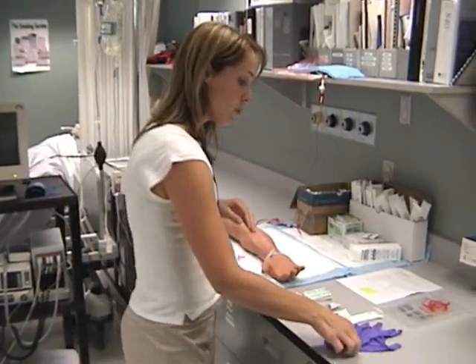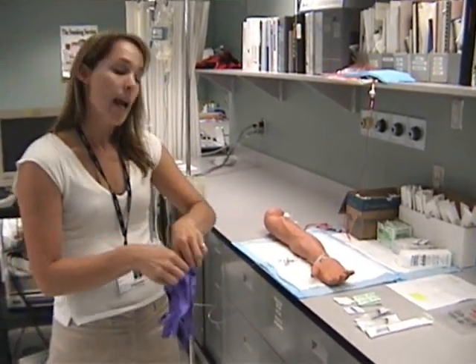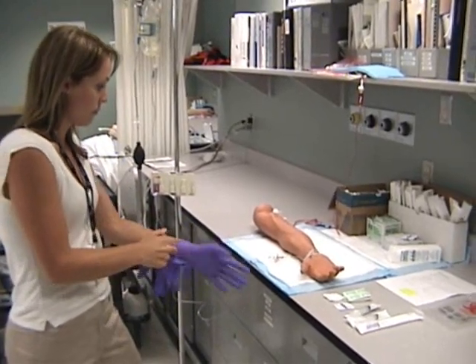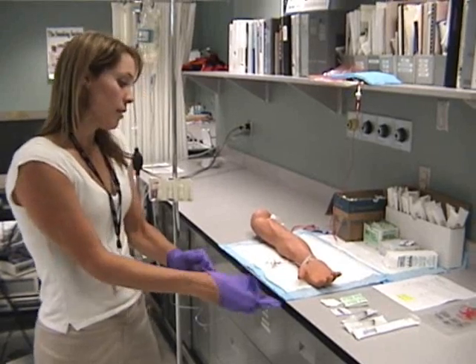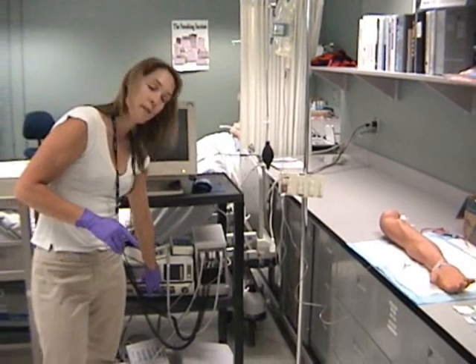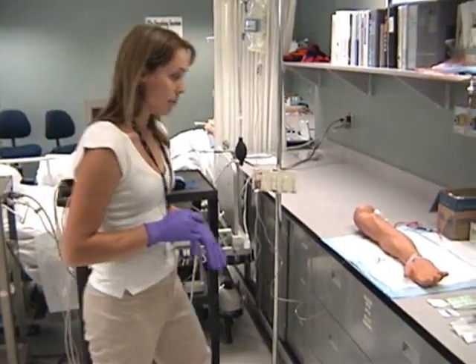When you're ready to do this, wash your hands first and then don your gloves. Before you start messing with this system, silence your alarms because they'll be going off throughout the whole procedure otherwise. So make sure you silence the patient monitor.